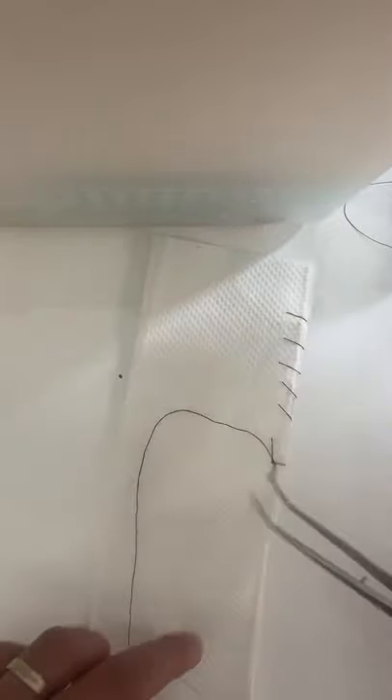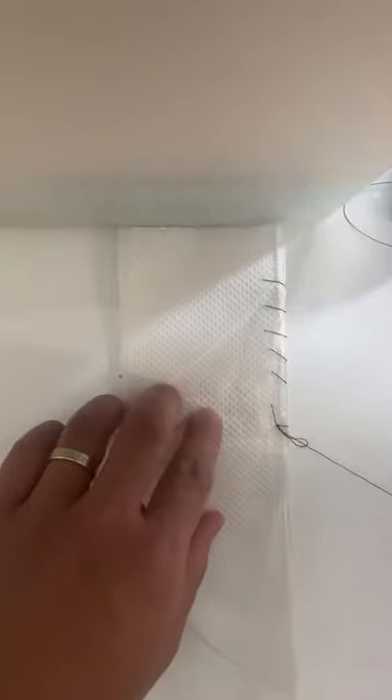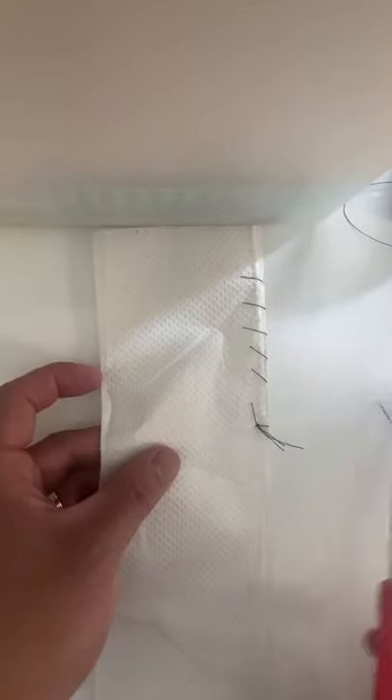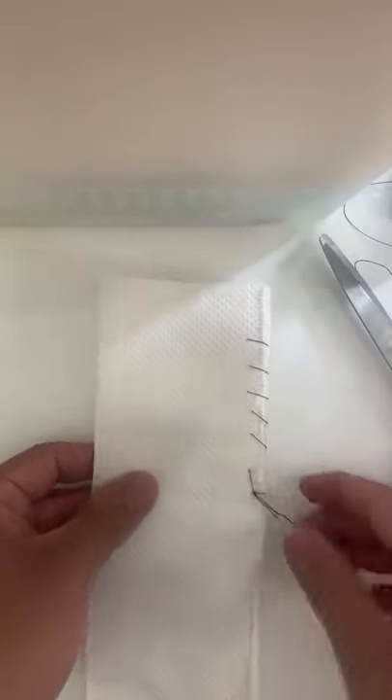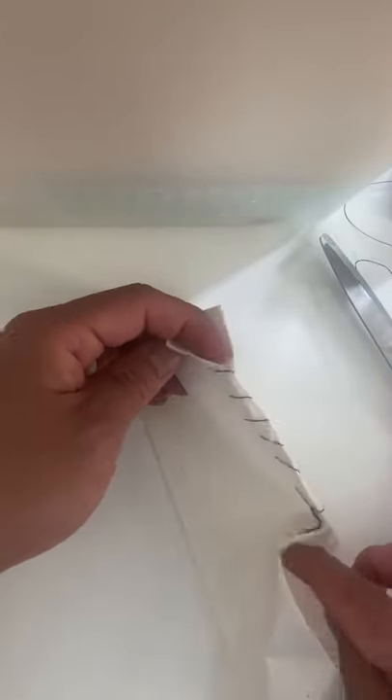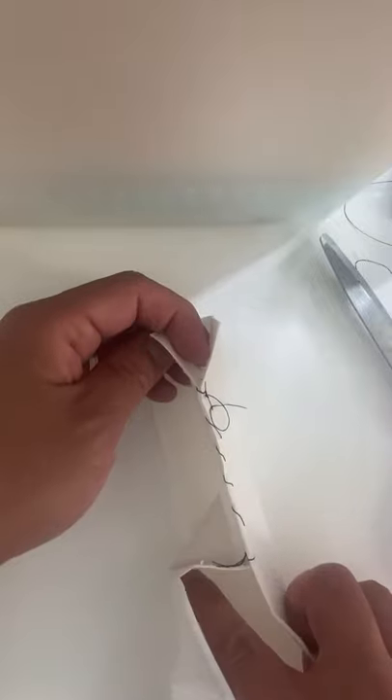I still have my loop here — that's my point of reference. Instead of going forward, I'm going to go reverse once, and pull through. And now I can grab my scissors and cut it off here. And now I have a continuous running suture. We got some closure here — so if these were a cut, we just closed the wound.